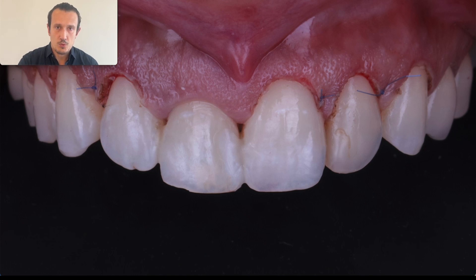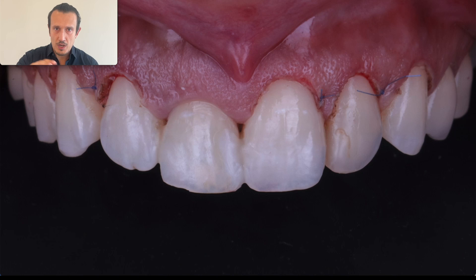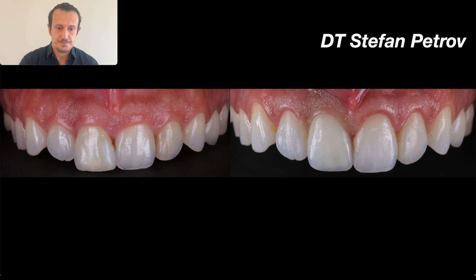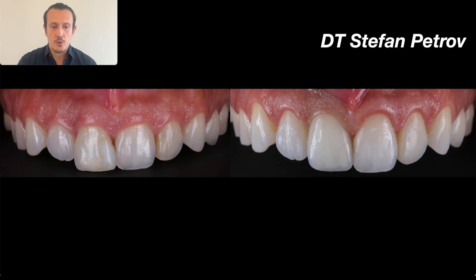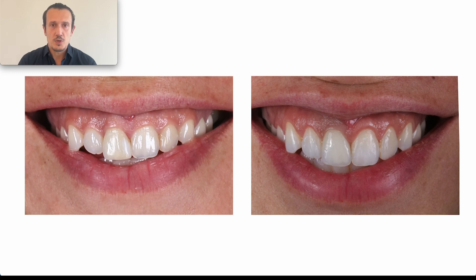To summarize the key elements: we performed crown lengthening on the rest of the dentition, saved the excess soft tissue at the implant site, and managed to create a nice gingival outline and perfect emergence profile without using a connective tissue graft. This is the before and after — you can see how we were able to expose the natural anatomical crown of the patient, which reduced the gingival smile, improved the harmony, and gave better proportions to the teeth.